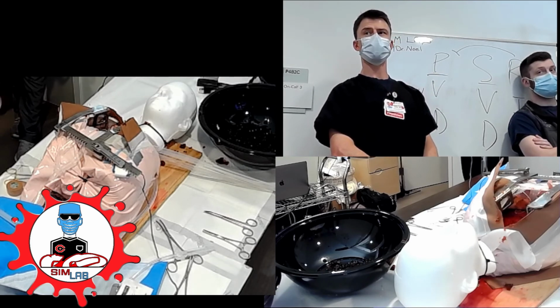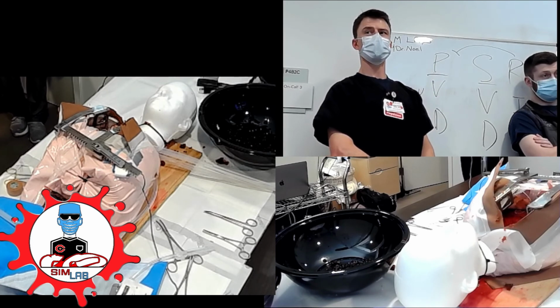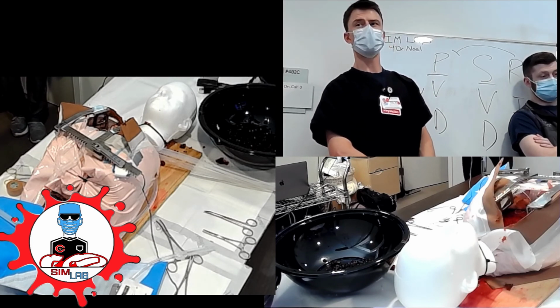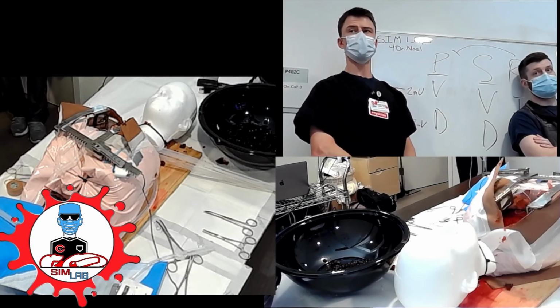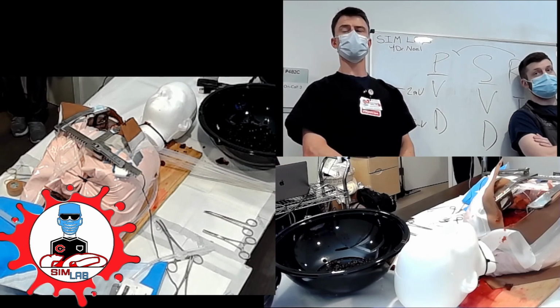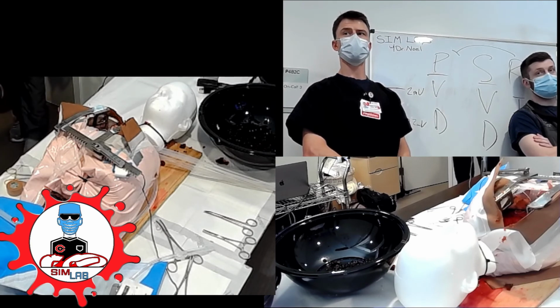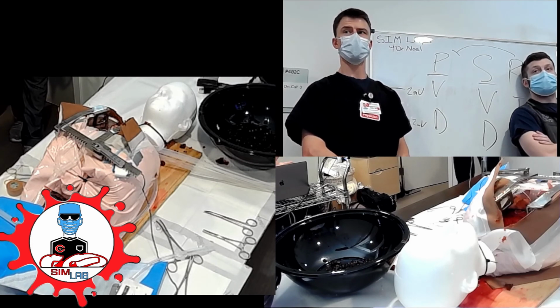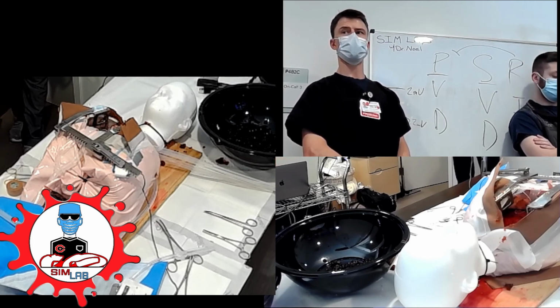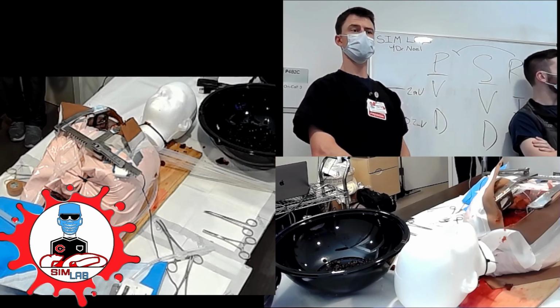We have a lot of new heart nurses. And as you onboard new people, I think a lot of us take for granted there's people in there that live their lives stripping tubes. When I was a fellow, it was like a never-ending process of tube stripping. Sometimes you won't know where they're bleeding from, different attendings use different connectors, and you don't always know which ones are the mediastinal drains and which are the pleural drains, depending on the surgeon. Many of us will know because we're used to what they use. You guys might not have any clue which pleural drain could be coming off of the right side. Everything could be crisscrossed inside. So the point here is you really need to be able to strip tubes.